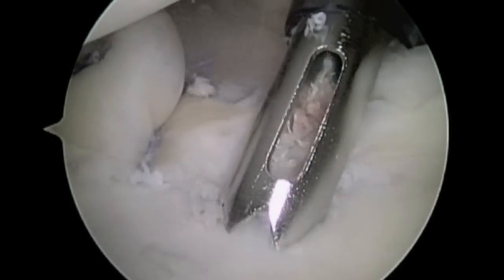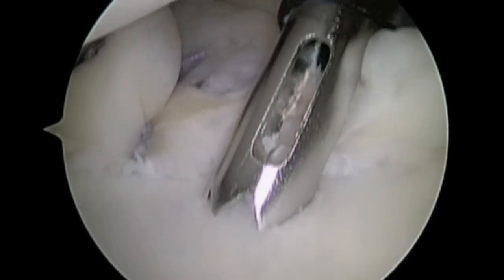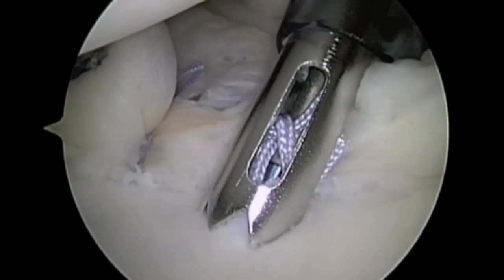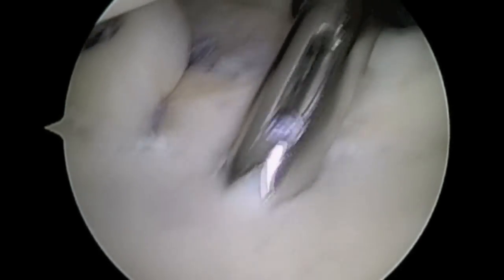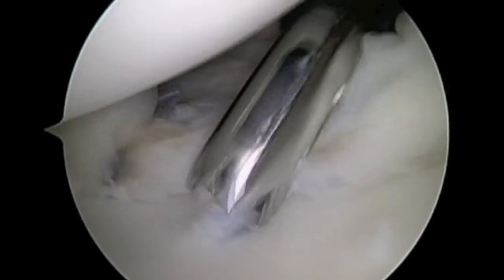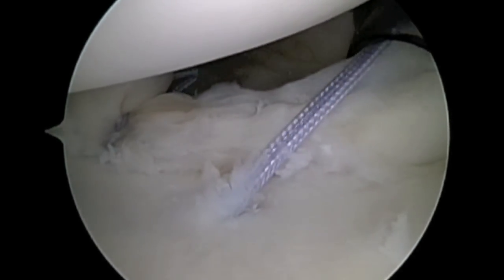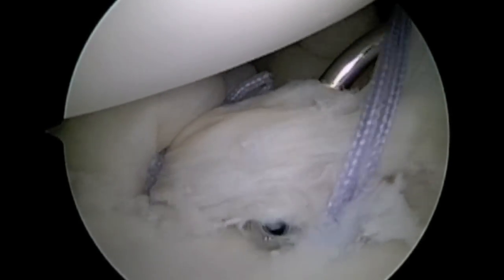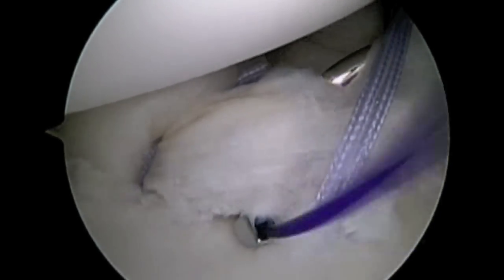A third anchor is being placed. In a typical Bankart reconstruction, three anchors are used. For larger tears, additional anchors may be used. The process is then repeated for the third anchor.